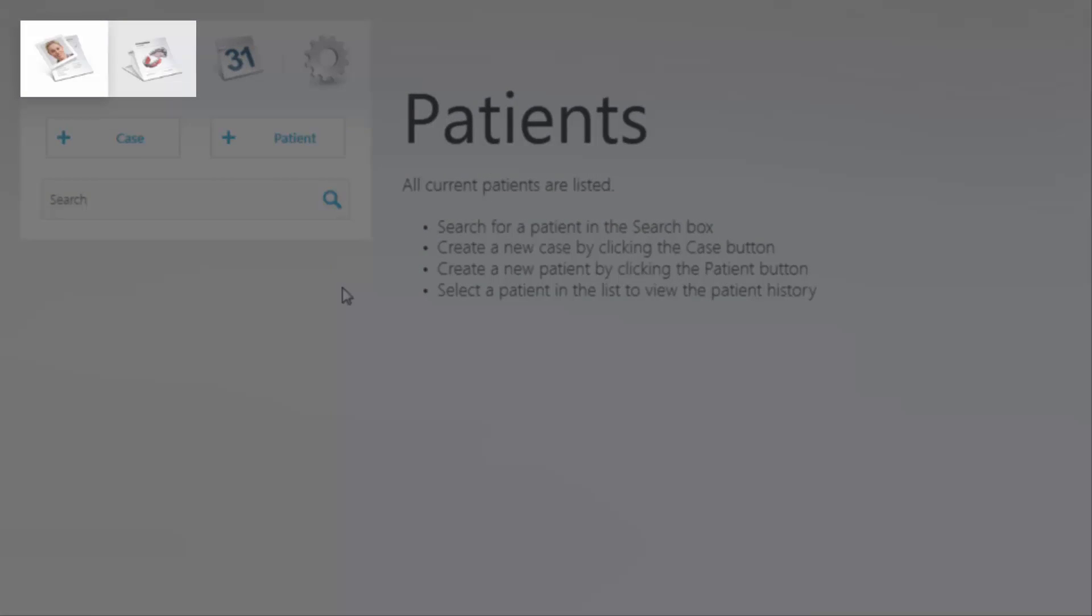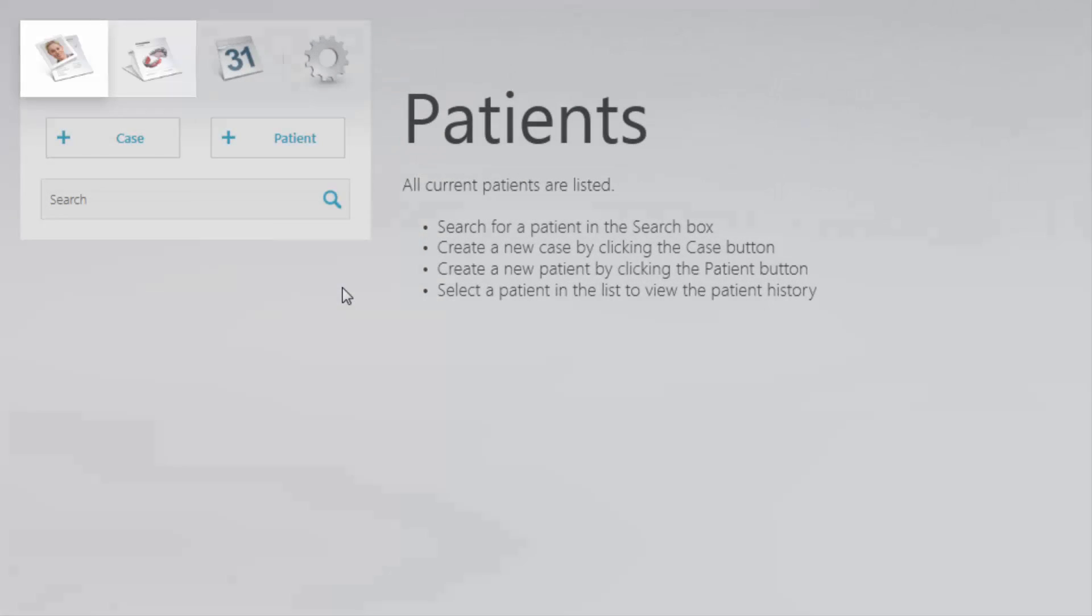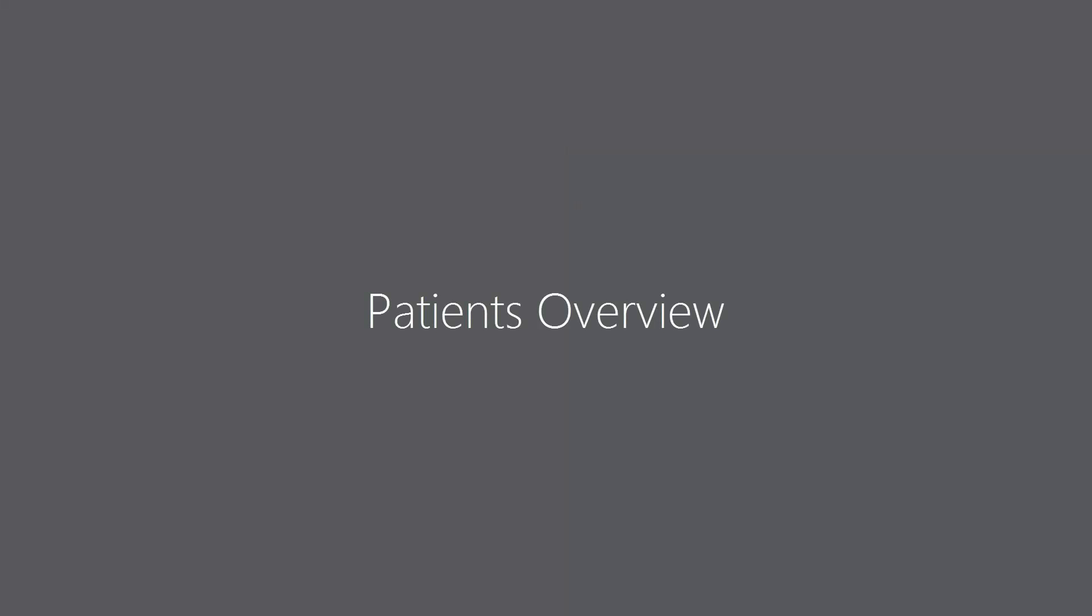You can create new cases from the case or patient overviews. Let's first look at how to create cases from the patient overview.